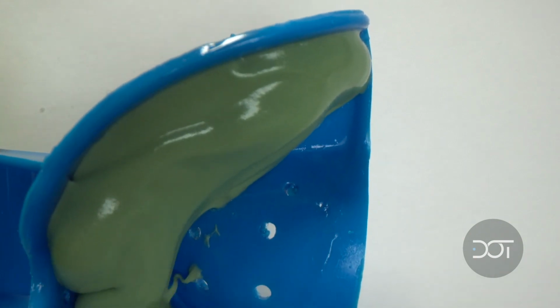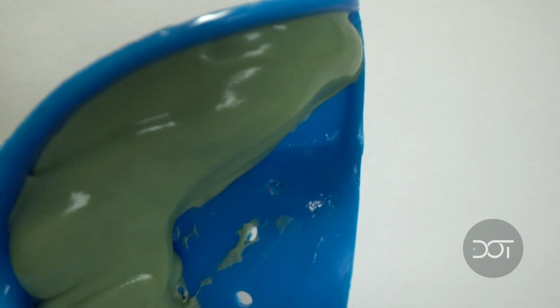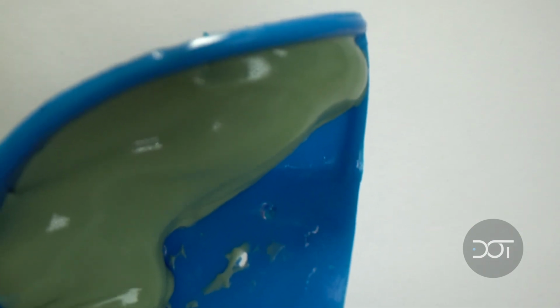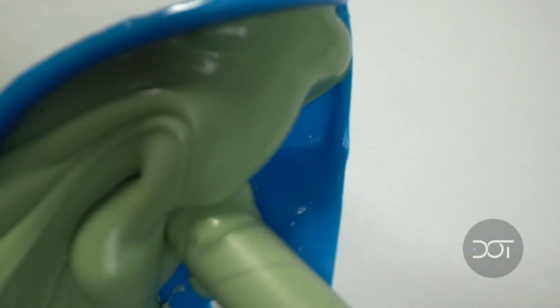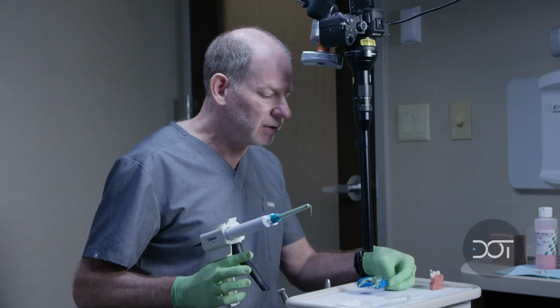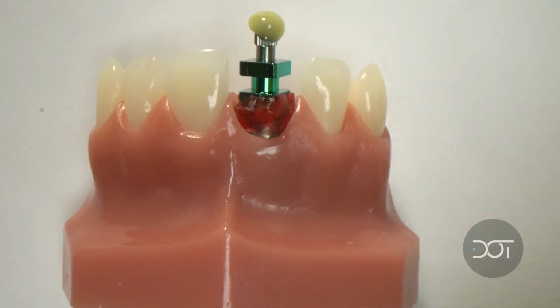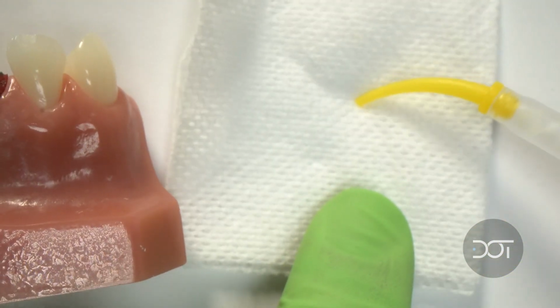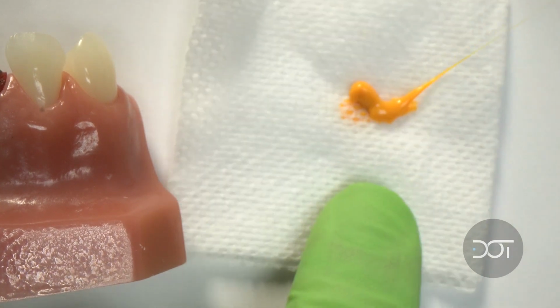It doesn't overflow, so I don't have to worry about it running through the hole that I created for access to remove the screw for the open tray technique. I'm going to set this to the side. Now around the implant itself, I'm going to start out, I'm going to bleed my light body material. Move that to the side.